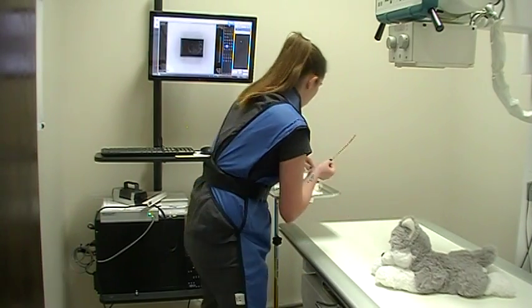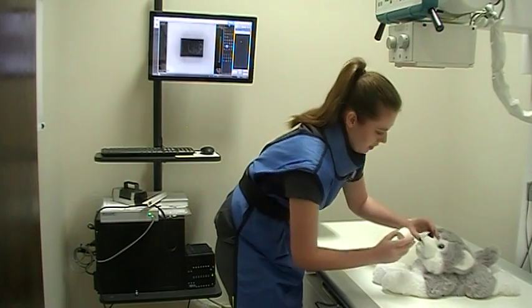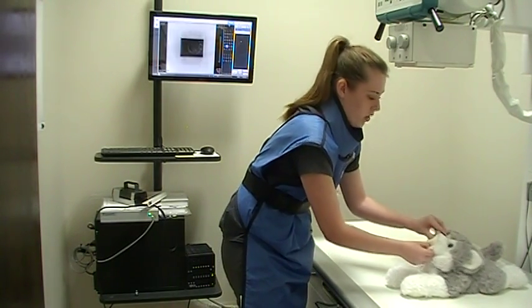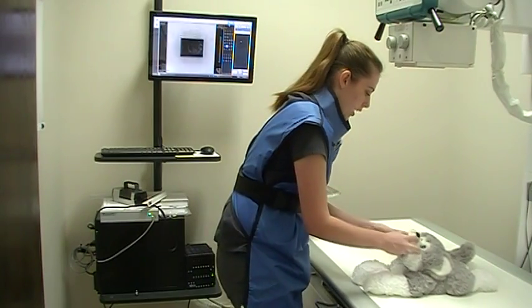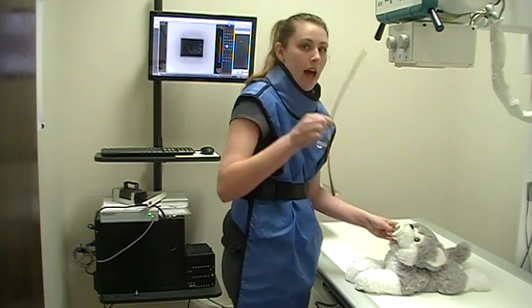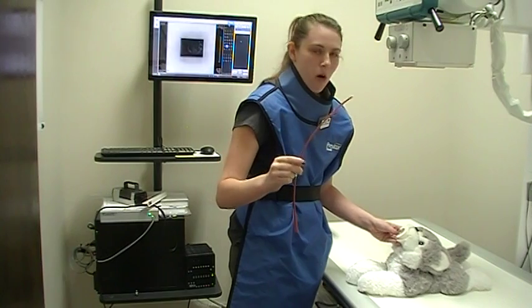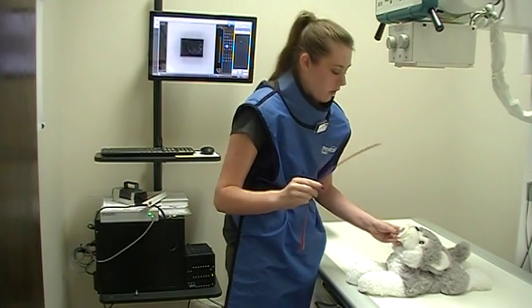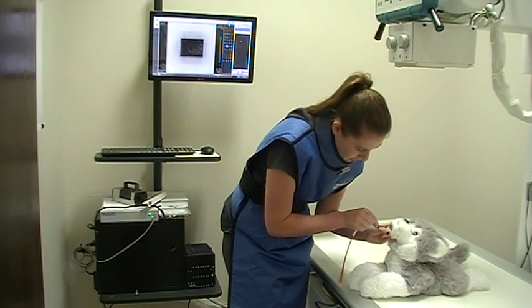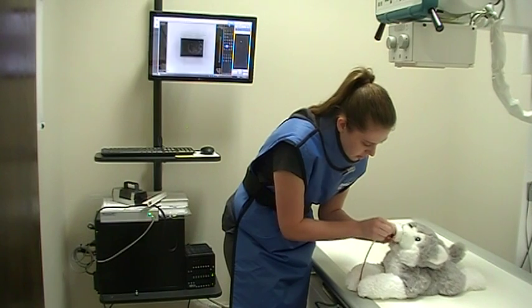Now we are also going to use our mouth gag. The purpose of the mouth gag is just to make sure that our patient is not going to bite down on the tubing. We have our mouth gag and our tubing which I have marked with a little piece of tape so I know exactly how far to go — you can mark it with tape or a marker. And I am just going to go smoothly into the stomach.